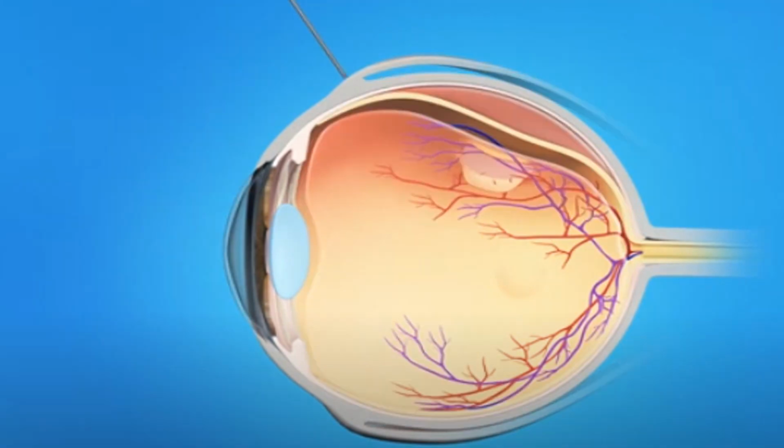Okay. So Dr. Sharif, you have told us about the scleral buckle, and we got it. Why don't we continue to the other two ways, which is vitrectomy or using pneumatic retinopexy? We agreed that pneumatic retinopexy means that we are fixing the retina using air. Okay, so here we are having the tear on the retinal detachment. From the first look, we are having a tear, so obviously it was rhegmatogenous. The tear was open, then fluid was accumulated here. So we need to close the tear and to push this detached retina against its normal place.